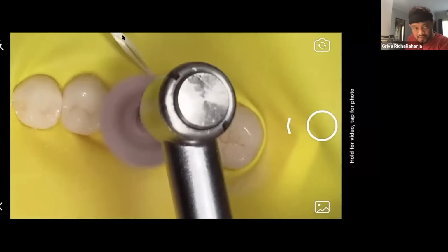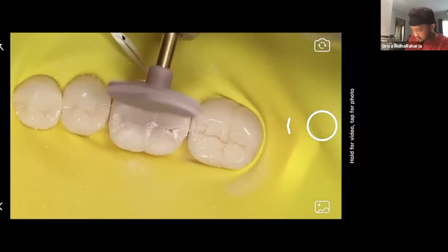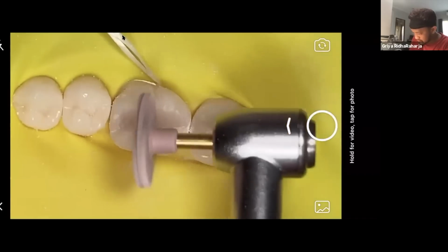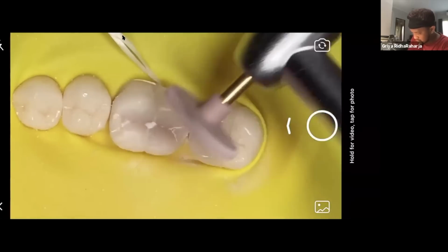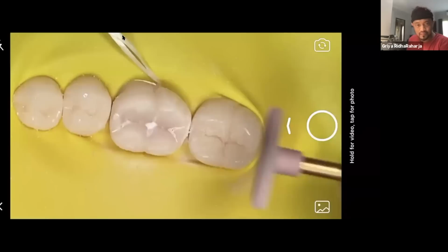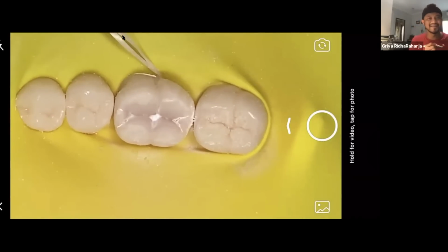I don't like this. This is useless, yeah. But using like this, yeah. Okay. Oh, very ugly. Okay. This is not finished, yeah. I know this has happened to you. Okay.